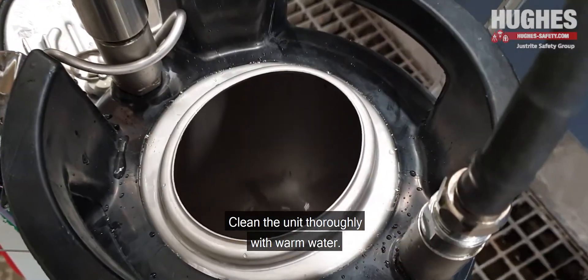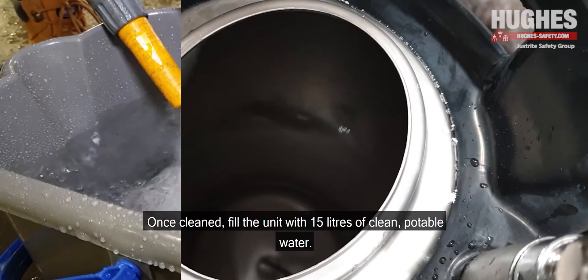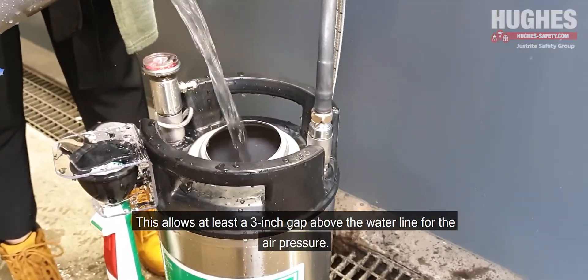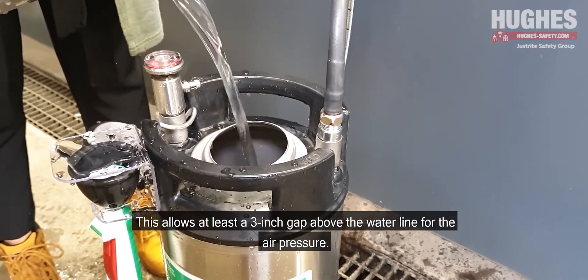Clean the unit thoroughly with warm water. Once cleaned, fill the unit with 15 litres of clean, potable water. This allows at least a 3 inch gap above the water line for the air pressure.